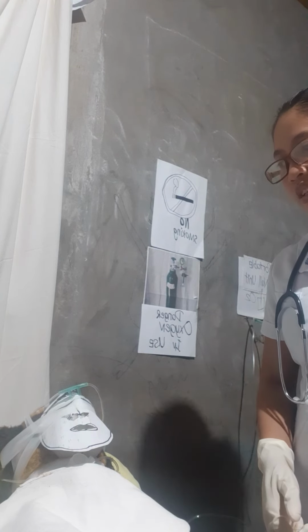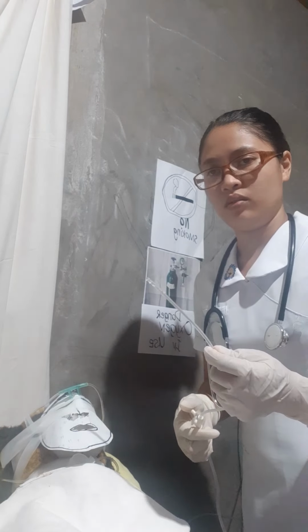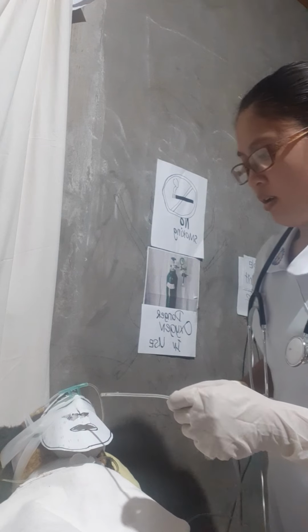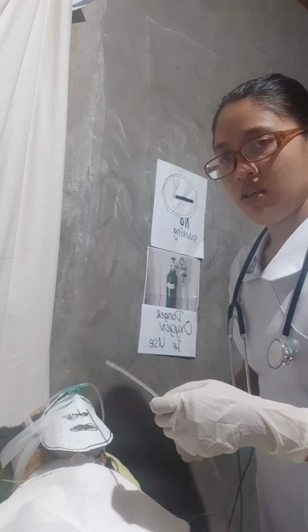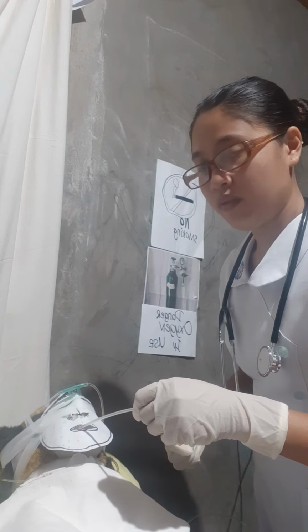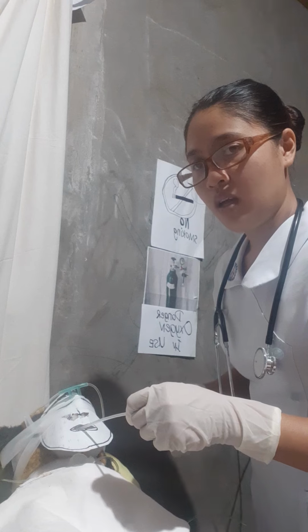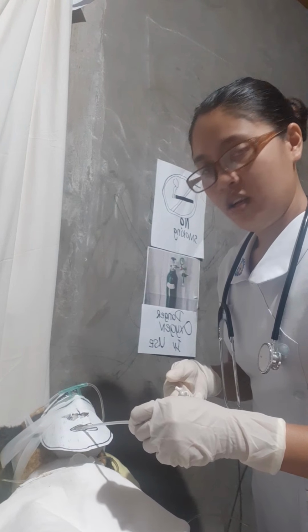in oropharyngeal suctioning, we need to insert the catheter into the mouth of the client. Then it should be also gentle, from the mouth, floor of the mouth. And take note that when we are going to insert, not to suction.